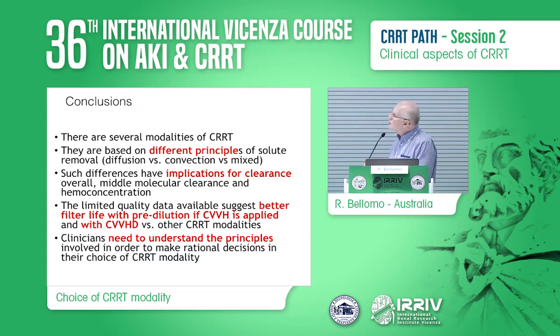There is only limited quality of data available, but the data that are available, as systematically reviewed by Sean, show that there is better life for CVVHD compared to CVVH. And the data that I presented from our group suggests that there is better filter life with pre-dilution versus post-dilution.